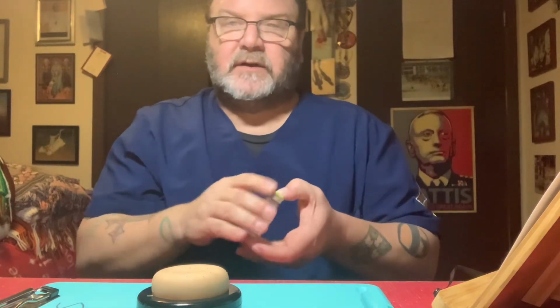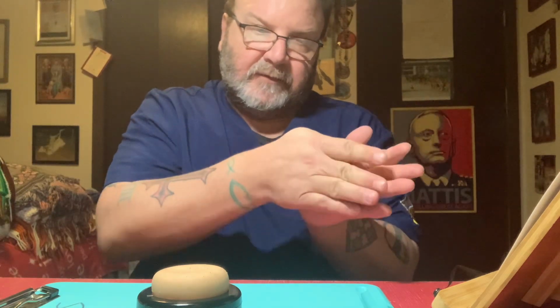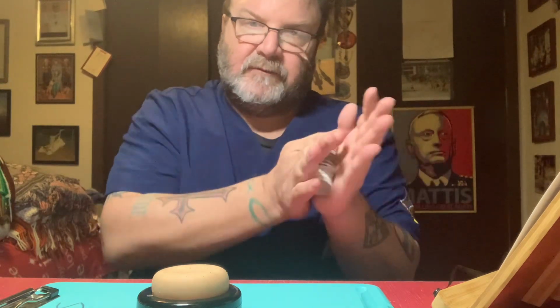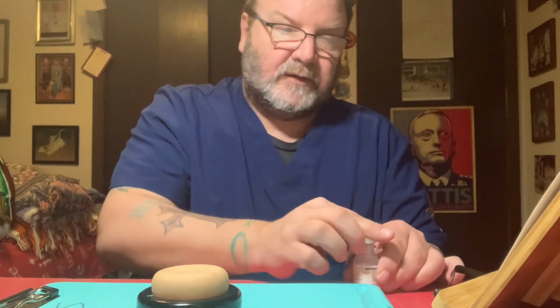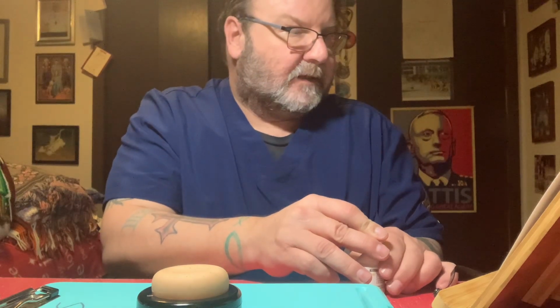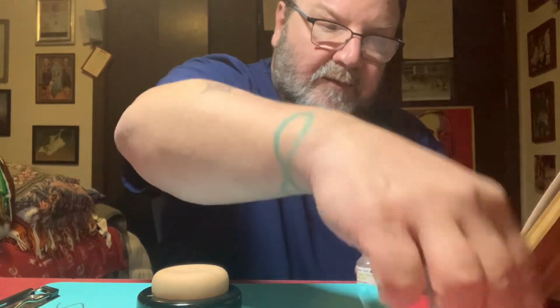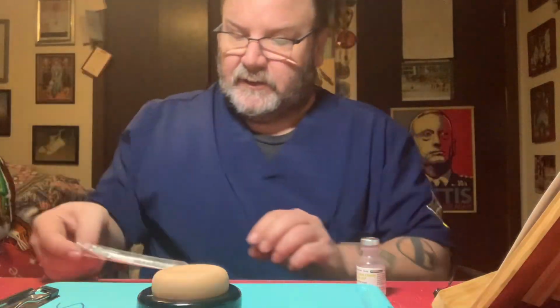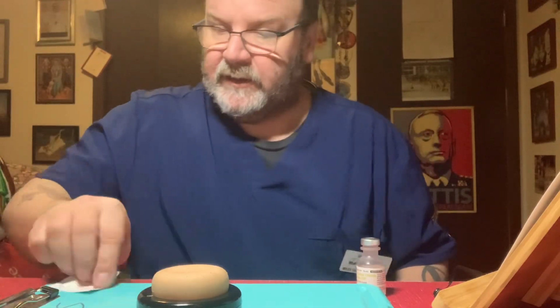Okay, I'm gonna kind of mix this by rolling it slowly in my hand. Not gonna shake it, not gonna vigorously do it, just slowly roll it. Okay, now I'm gonna remove the cap. Make sure my surface is clean here.